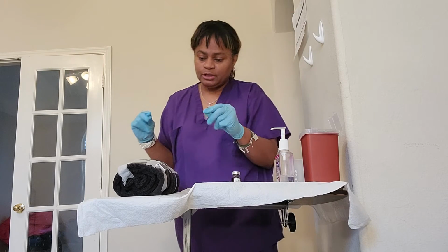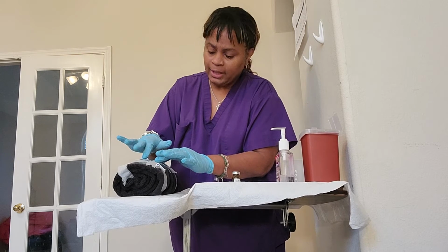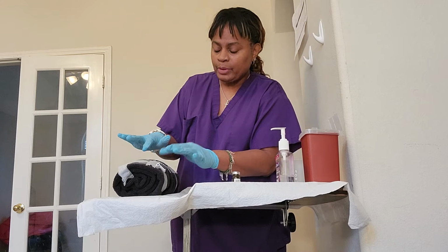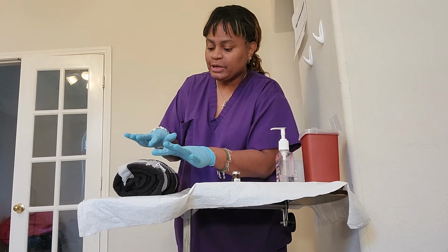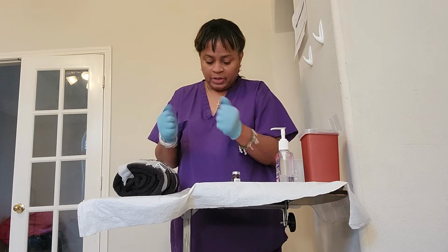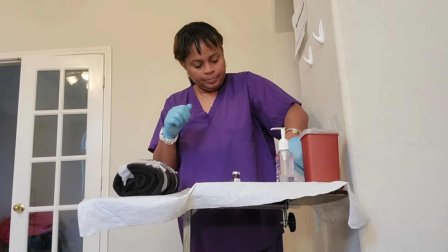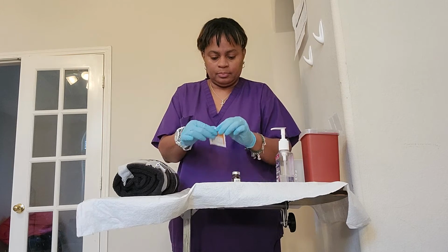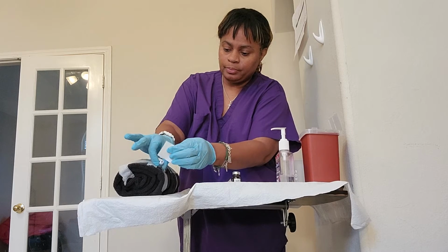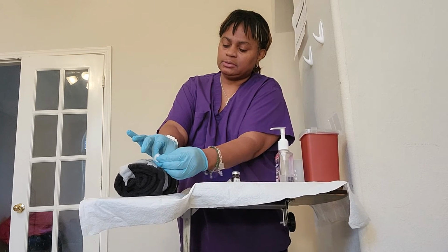Okay, so the first thing I'm going to do is assess your site. Does that hurt? Okay, it's good. So there's no swelling, there's no pain, there's no redness, there's no infiltration or any signs of discharge or infection. Okay, so the next thing I'm going to do is I'm going to get an alcohol pad. I'm going to clean your hub, being careful to make sure that I do it for about 5 to 10 seconds.